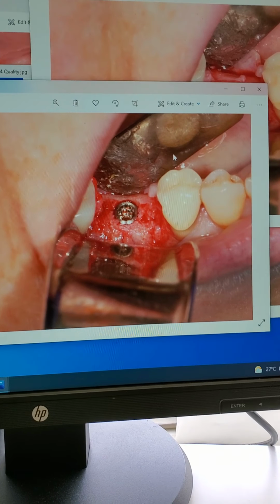So the idea is, if I was to put it in a summary, your flap design, not just design, the passiveness is critical. It's critical. When you pack bone, you don't pack it too tight. I've made that mistake. I used to pack it like crazy tight. Doesn't work. It leads to resorption. How do you stabilize the membrane? People use tacks. That is amazing. Yes, I have done that. Screws, I've done that. Now, most of the time, I would suture it up. Sometimes I don't stabilize it, but it's not very often. So it's very important, these small things.